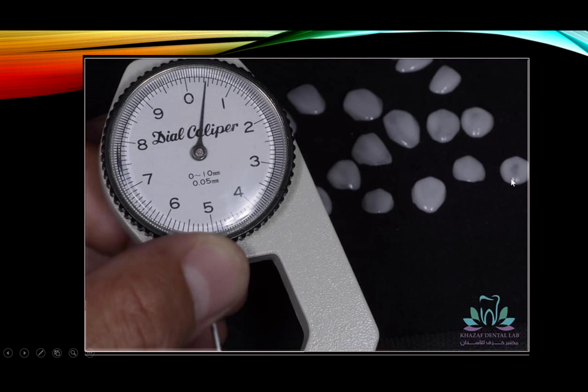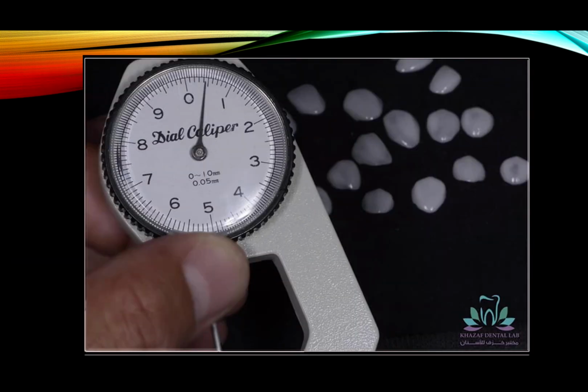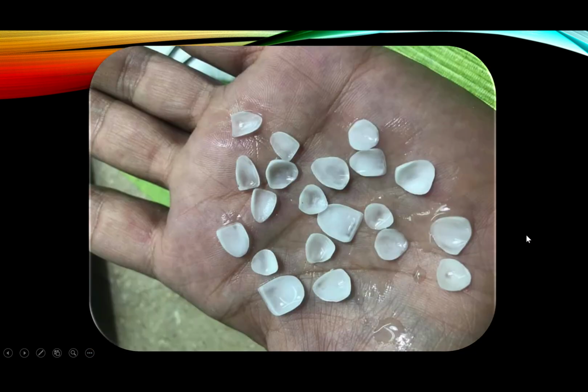Look how thin. This is the case that you looked at here. This is the case, the same case. All right, look here. You're talking about some areas, it's nothing. It's very translucent. It's very thin. I know it doesn't show very well because my concentration was on the caliper, but whatever, it is thin. All right, 0.4 in certain areas.